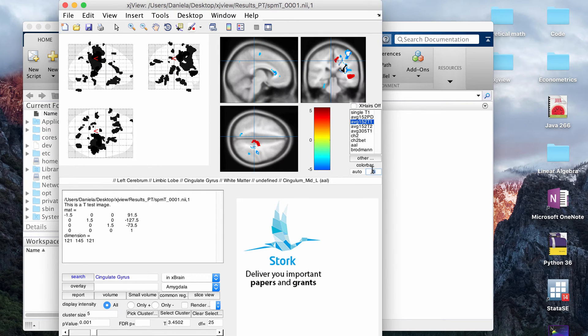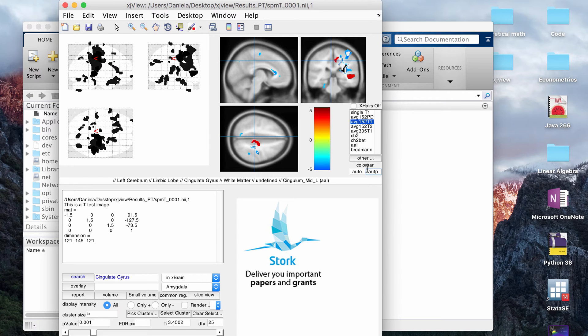Then if you want to undo whatever range you picked, you can just type in auto and auto again, and that will set it back to the way it was. So that updates.